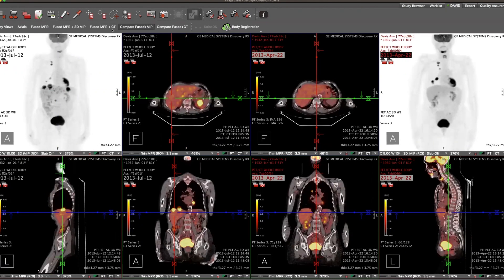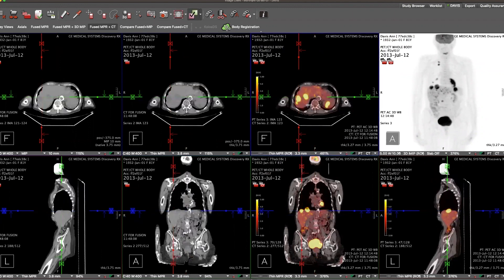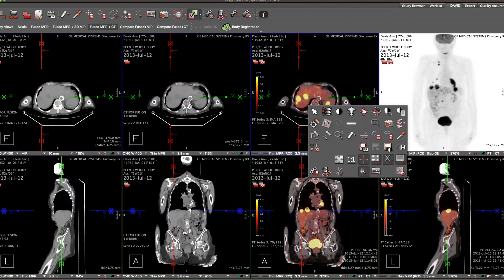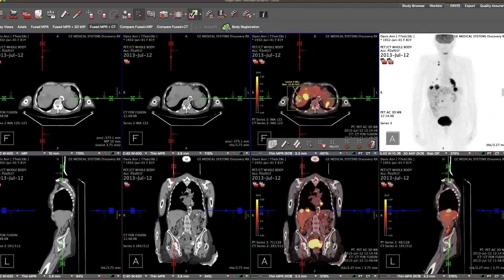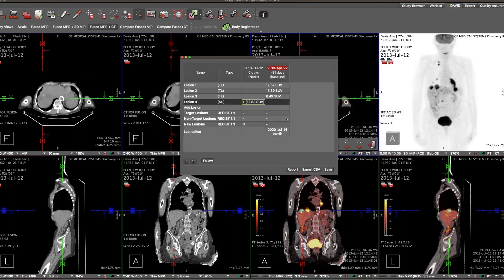Now we will switch over to the layout showing just the current study. Using my 3D MIP, I'm going to target on a hotspot. In our axial image, we're going to bring up our tool palette — a lesion tool that will allow me to single click into the hotspot and obtain a maximum SUV. From here, if I'm going to track this over time, I can bring up again from my tool palette a tracking table that allows me to save this as a DICOM structured report, which will then be available when the patient has a follow-up exam.